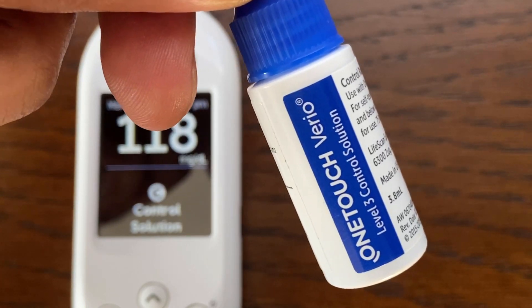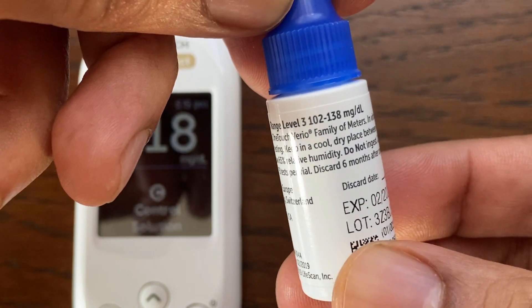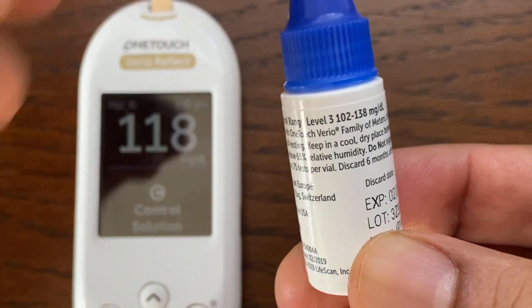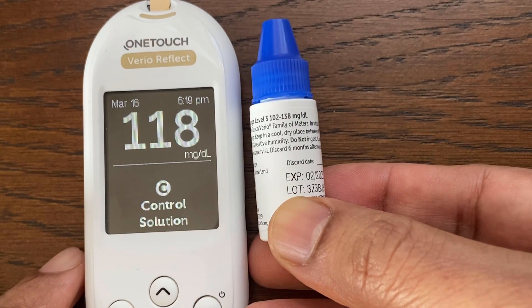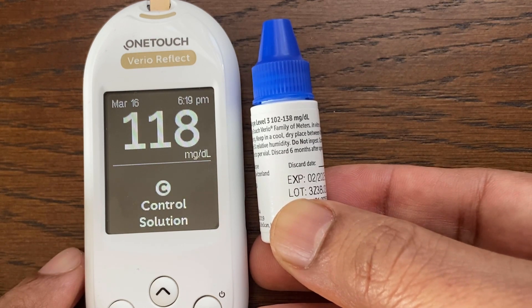Compare the result displayed on the meter to the range printed on the control solution vial. The result should fall within that range. In this case, the control solution is level 3, and the expected value should be between 102 and 138.